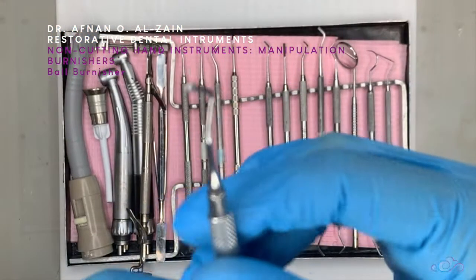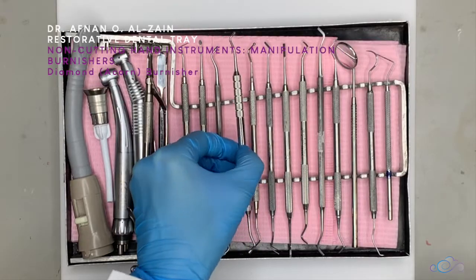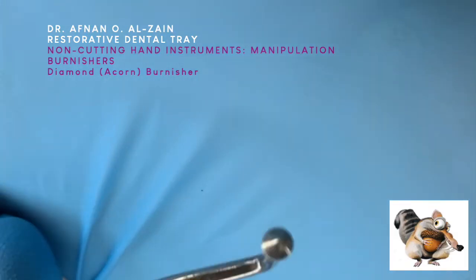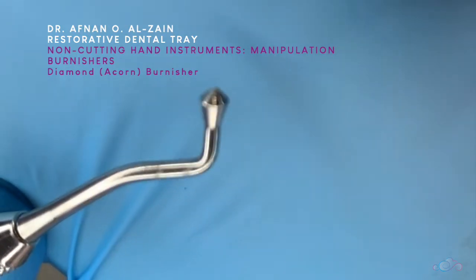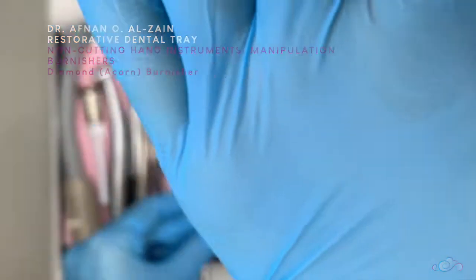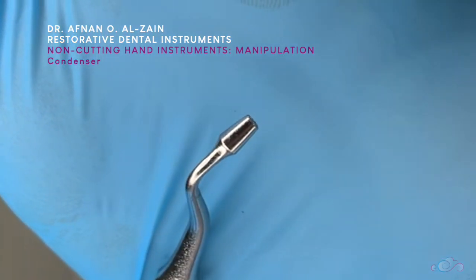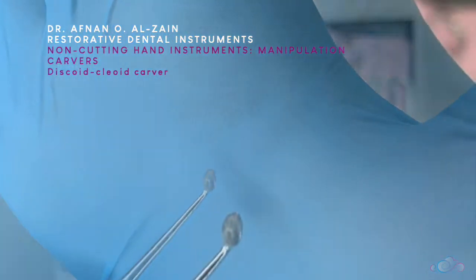The bowl burnisher is used either for amalgam restorations or for composite restorations as well. After that we have the diamond or acorn burnisher, also usually double-ended with two sizes, and this is used to form anatomy in either composite or amalgam restorations. This is a condenser, used to condense amalgam restorations — it's also usually double-ended, and sometimes we use it to pack composite as well.